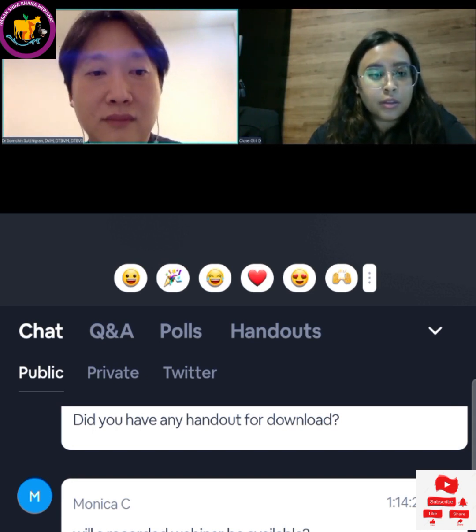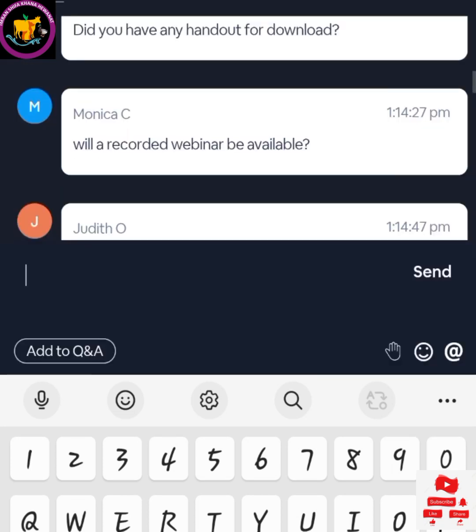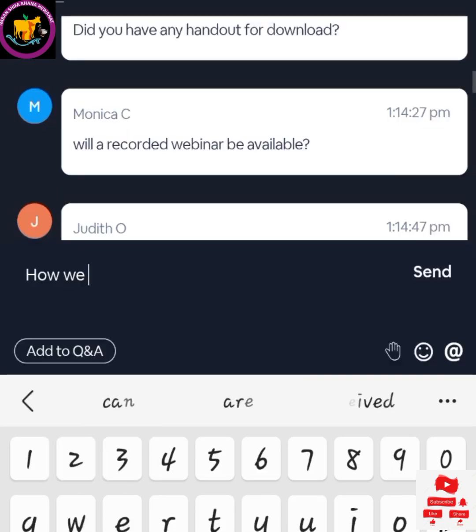And then for our next question, we have coming in from Siddhartha: how do we detect pyometra? I'm so sorry if I'm pronouncing that wrong, but yes, the person asked, how do we detect pyometra and how can we differentiate pyometra and content in GI?